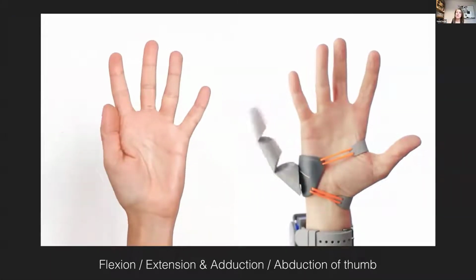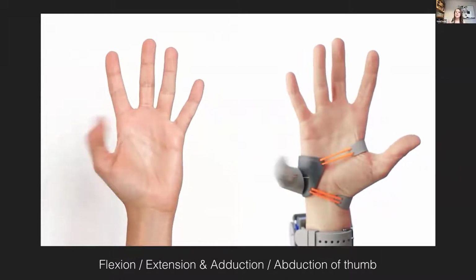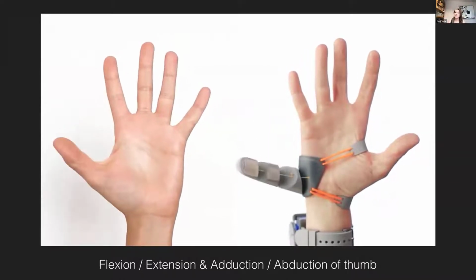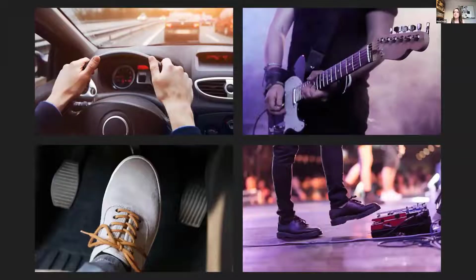So the third thumb recreates 2 main movements of our thumbs, which are flexion and extension, and adduction and abduction. These are wirelessly controlled by 2 pressure sensors underneath the big toes. The foot control idea came out of a side research project of mine into alternative body control, but it was mainly because I couldn't get 2 individual muscle sensor control points from my arm without having to move my hand. And I wanted the thumb to be its own controlled entity away from the arm.